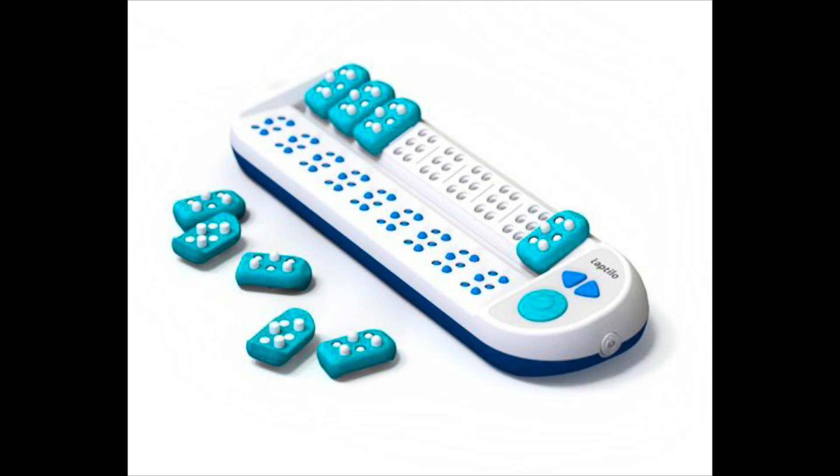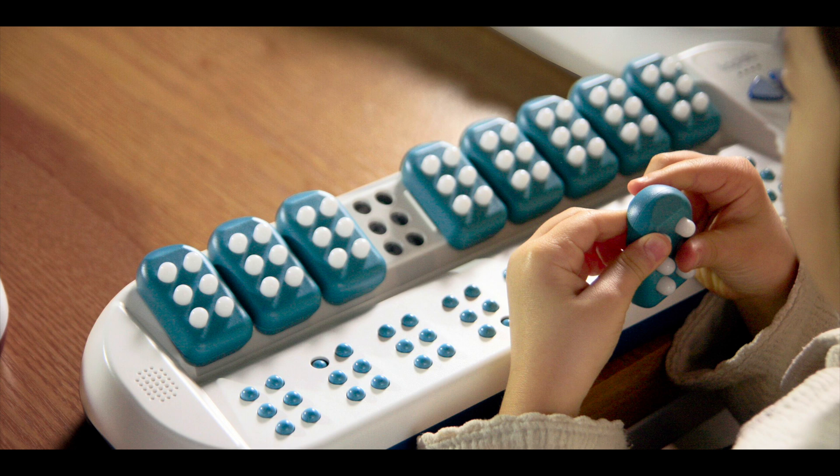Hello, my name is Sharon Lyons from Sight and Sound Technology. Today we're going to have a look at the TapTilo, which is a smart braille learning device, mainly used in school or at home, mainly for children to learn braille from scratch.